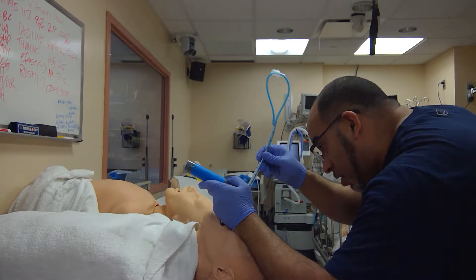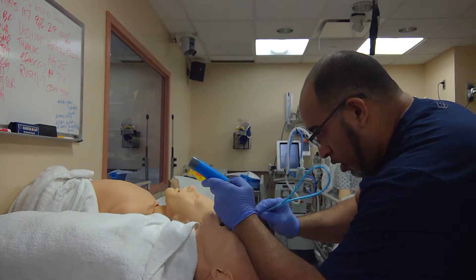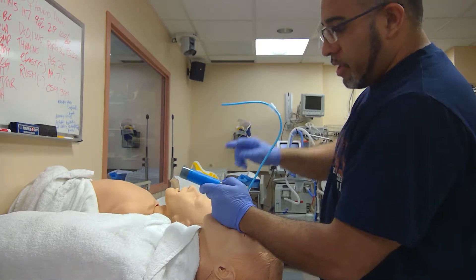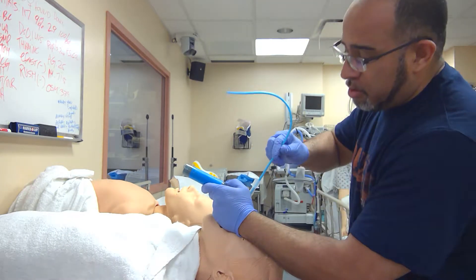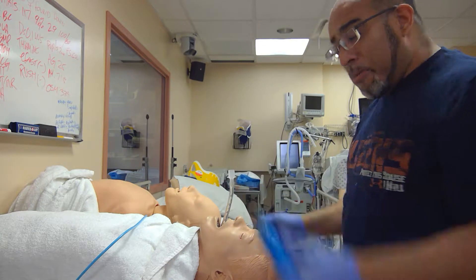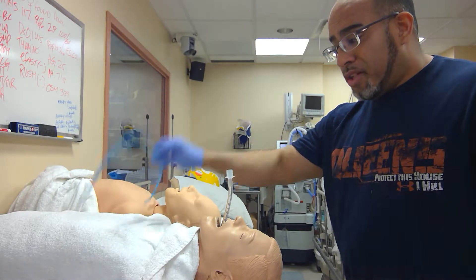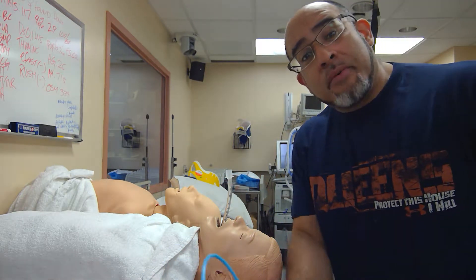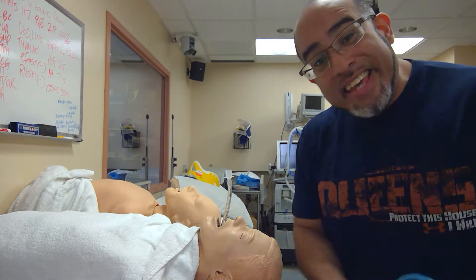Tip goes in. I don't care if I see a third of the glottic opening — I see an entrance, I see glottic structures. Aim for it, go for broke. Around 22–23 centimeters, hold up. Keep the blade in. Reconnect the ET tube holder, go back. I'm feeling for tracheal rings — I'm in. Capnography will confirm my confidence that I went through the cords. Now the issue with the bougie is you should be practicing on both easy and difficult intubations. I'm not in the realm of predicting correctly what is difficult and what is easy — I usually figure that out after I intubate the patient.